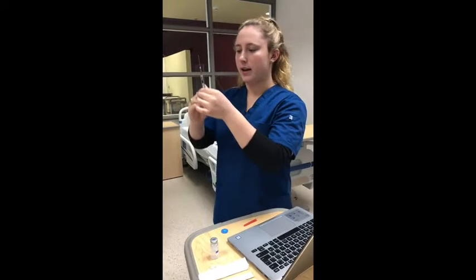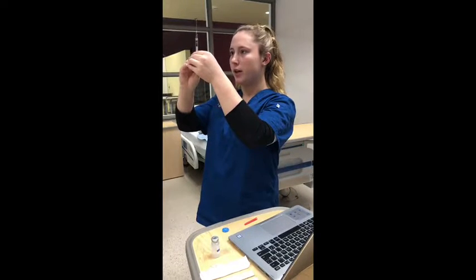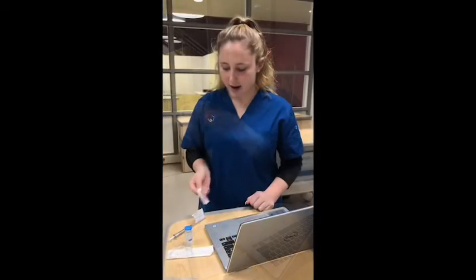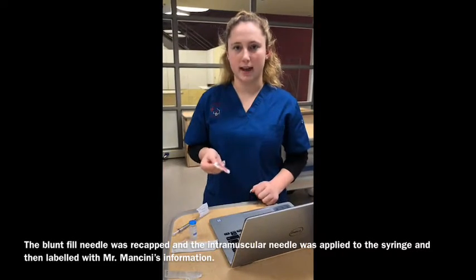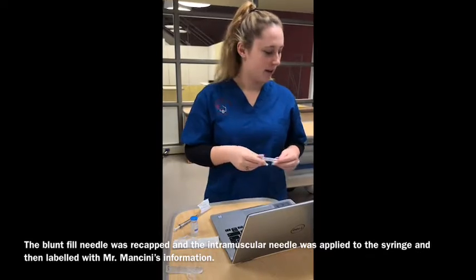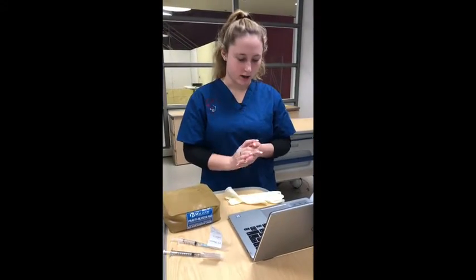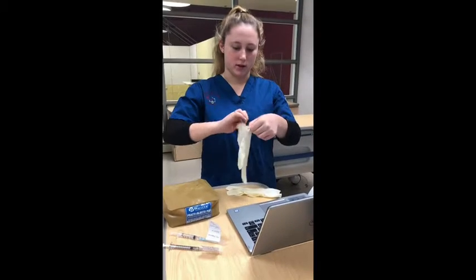And now I'm going to get out any air bubbles by pushing upwards on the syringe. So now that I have my needle labeled, I can throw the blunt fill needle in the sharps bin. So I would perform my hand hygiene to start, and then I would put my gloves on.